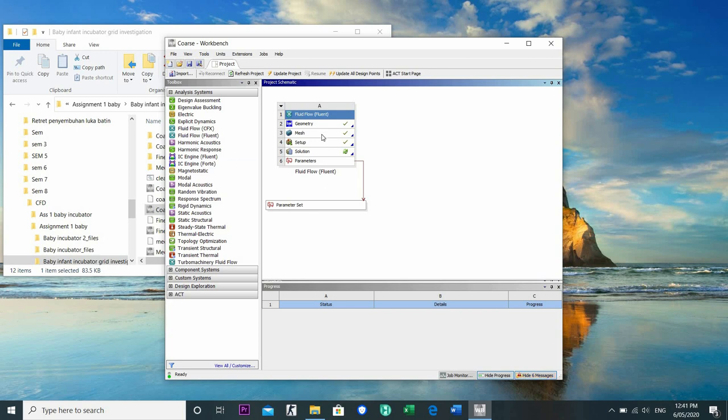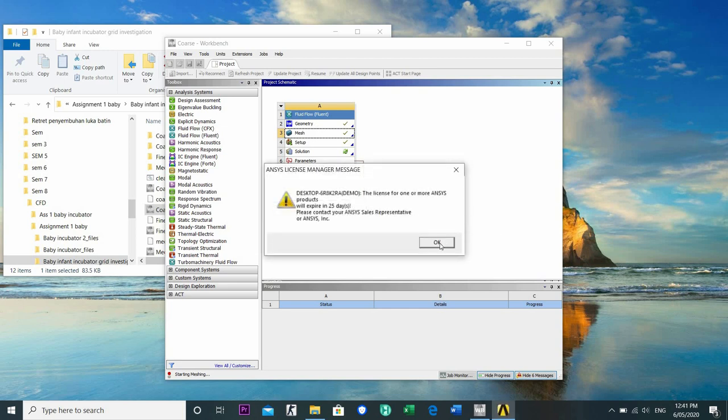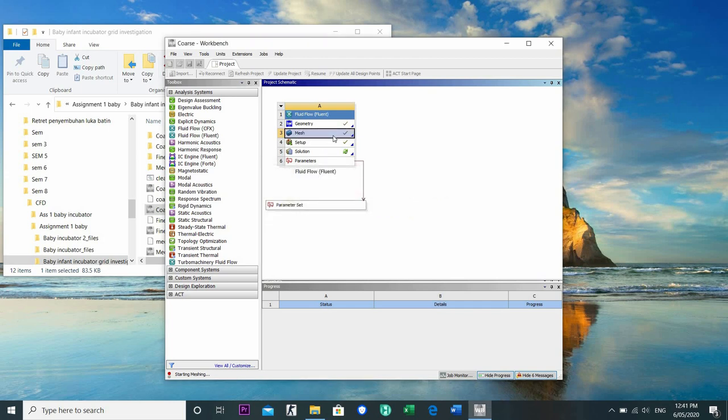Okay, as we can see, we actually don't need to set the parameter set because there is no parameter tick checkbox for the medium, coarse, and fine adaptive sizing.